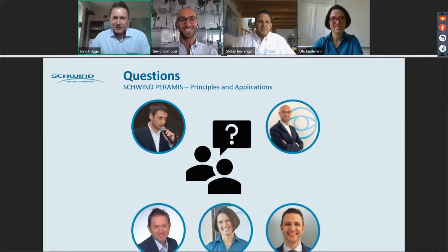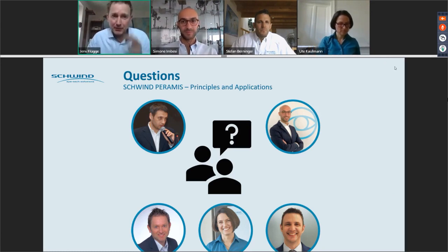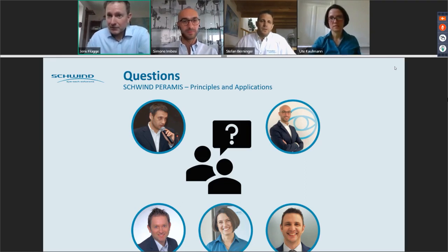Then I would just mention one more point: when you cover the eye, make sure that you're not really blocking it, because it's important that both eyes are open wide. Otherwise, if you block one, the other one cannot be open completely. So that's one comment I would like to give to this.